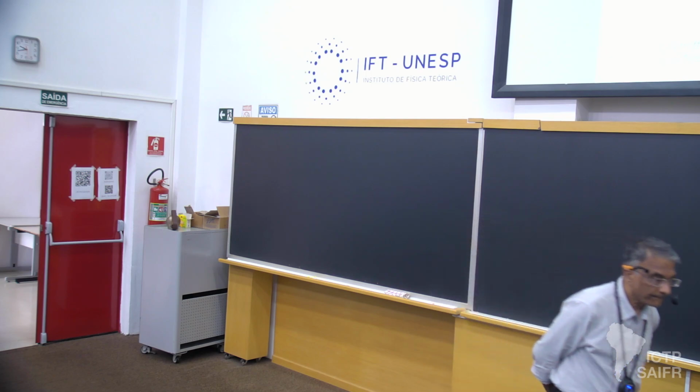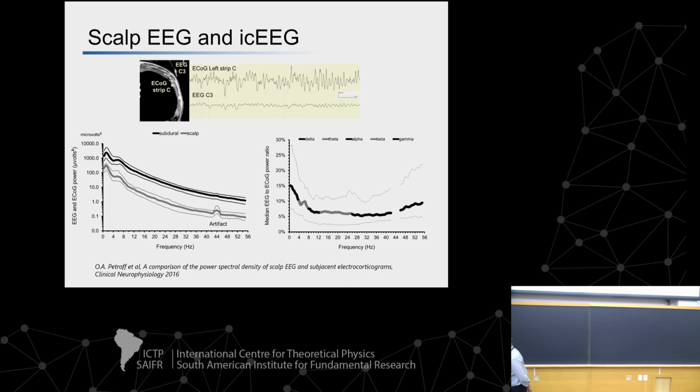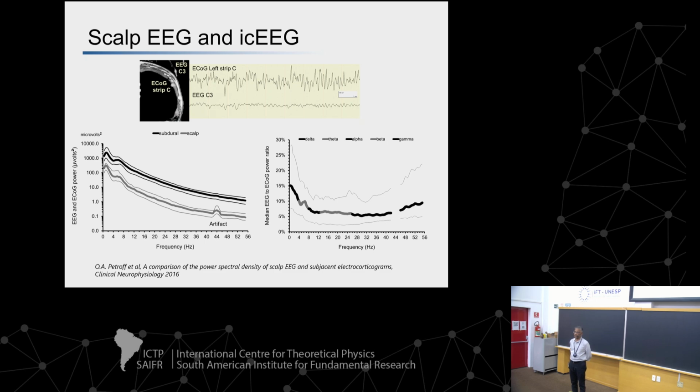About when you take the EEG, of course, you have all these peaks and ups and downs. And then you have, for instance, an artifact. I mean, the person moves, the person jumps, or whatever. These external impulses, are they more or less the same size in microvolts as a seizure, or are they much bigger, so that you can easily neglect them?